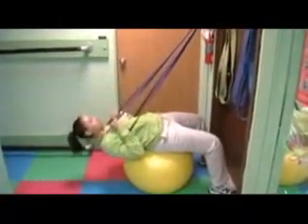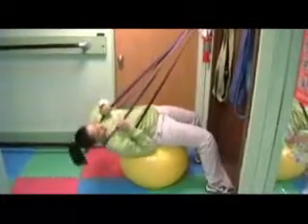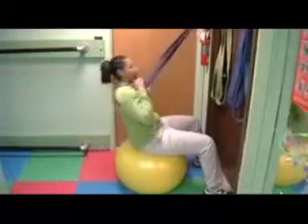Seated on a physio ball, you can do the same thing if people can't get down on the floor. They have to be very stable and put their feet against the door so they don't roll off the ball. Going into extension to parallel activates the erector and quadratus lumborum muscles of the lower back to strengthen them.